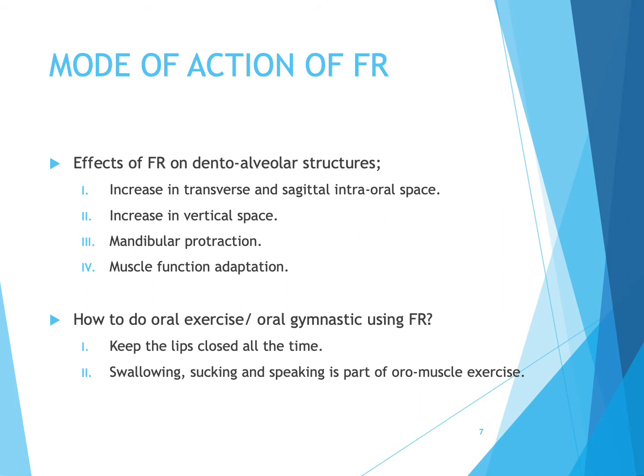Frankel also has recommended certain oral exercise that is called oral gymnastic. Some of the exercises recommended are to keep the lip closed at all times. This can be aided by asking the patient to keep a piece of paper between the lips. Then swallowing, speaking, and so forth become more or less an exercise when the appliance is used.